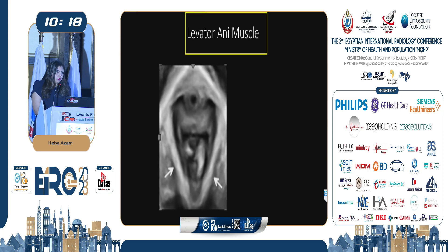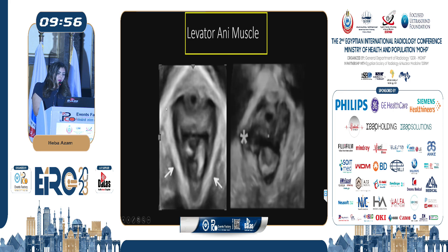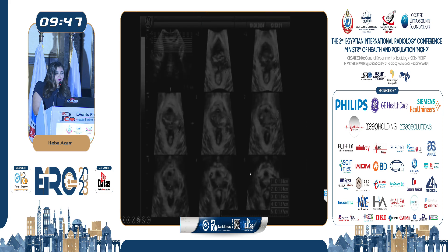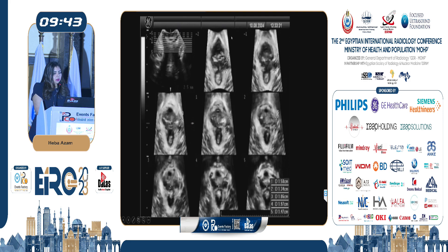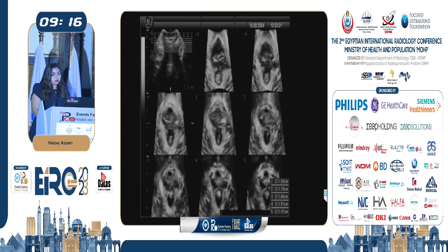The levator ani muscle can be assessed using transperineal ultrasound, especially with 3D and 4D reconstruction. We can properly assess the muscle's symmetry on either side, its thickness, and whether there is interruption of the muscle fibers. This shows the normal appearance of the levator ani muscle, while here there is a defect on the right side of the puborectalis muscle and a defect in the left sling of the muscle seen across multiple slices. Classifications by DeLancey and by Dietz provide scoring systems to grade the severity of muscle injury based on the percentage of muscle affected on either side and the number of slices involved.